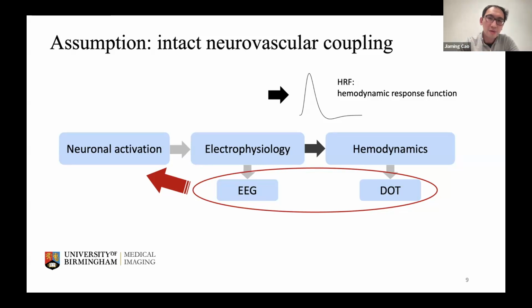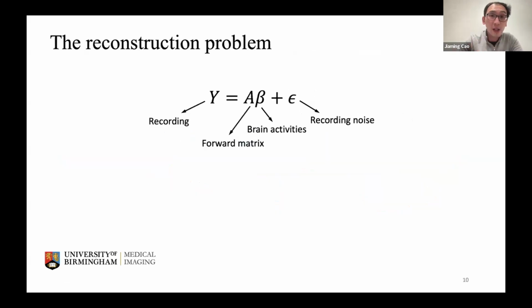Although I would say that in most cases, especially under controlled experiments, this in general holds quite well, and that is of course supported by a lot of fMRI literature and others. Another thing is that it will become clear later in the presentation. Should this HRF change its shape, what we can do is that in the first step, we quantify the shape of this HRF and substitute that into the algorithm, and then theoretically that should still make the result hold. So that was a very long one-slide summary.